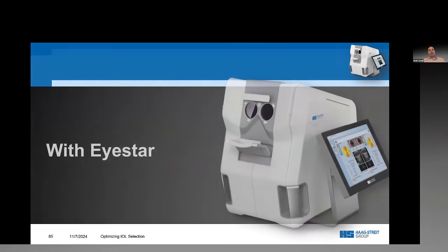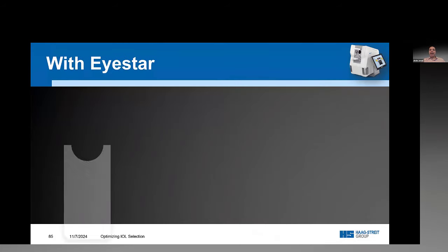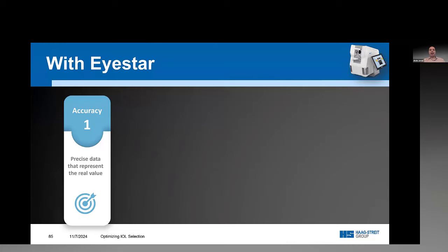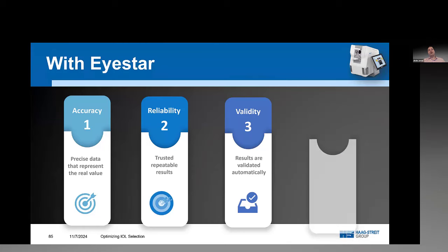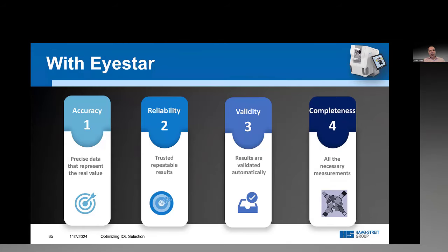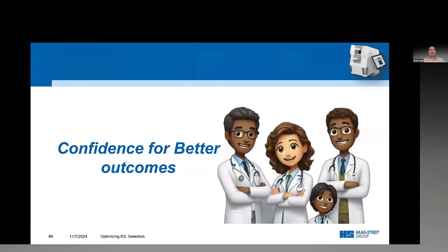So with Eyestar, your results are accurate, reliable, validated, and complete. Eyestar comprehensive measurements provide confidence for better outcomes. I will move now to show some demo cases where I can demonstrate how to use these measurements in real life.